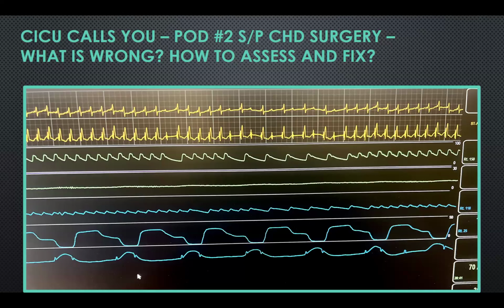Now, sometimes when the nurse practitioners or the physician assistants pull out the leads, they don't all come out. And so I'm sure you've seen or you will see that there are some patients who will have retained leads permanently. Usually when that happens, it'll snap off and a piece will remain in the heart or on the epicardial surface, and we just leave it alone because the effort to pull it out is far higher risk than just leaving it there. There are some patients who, many decades after congenital heart surgery, still have their temporary leads attached to the heart. There are obviously implications of that in terms of ability to have safe MRIs in the future.